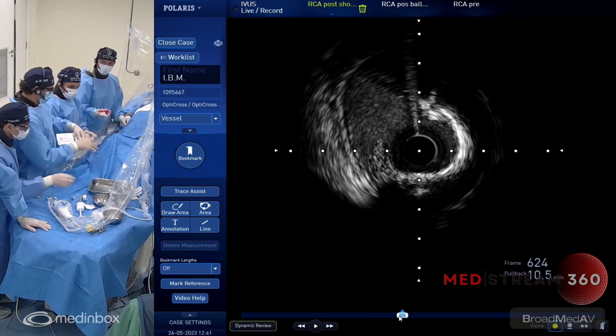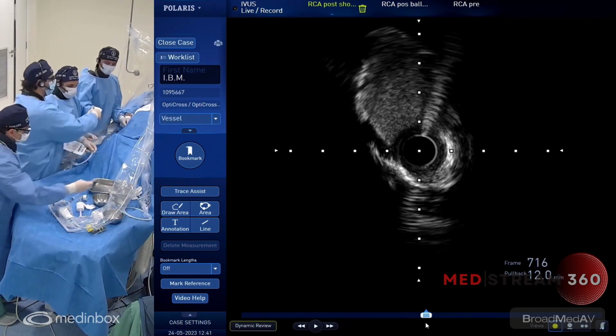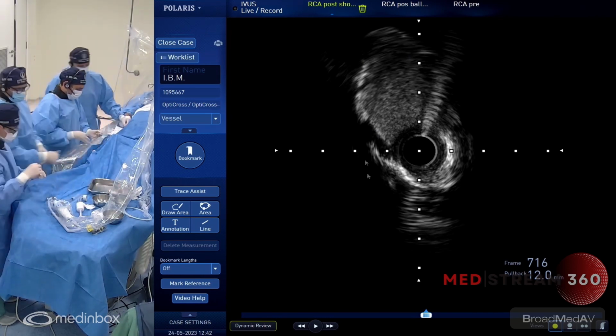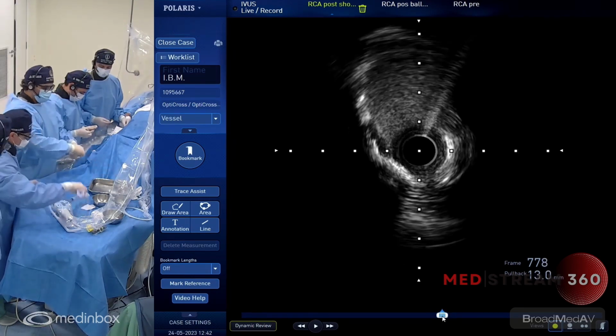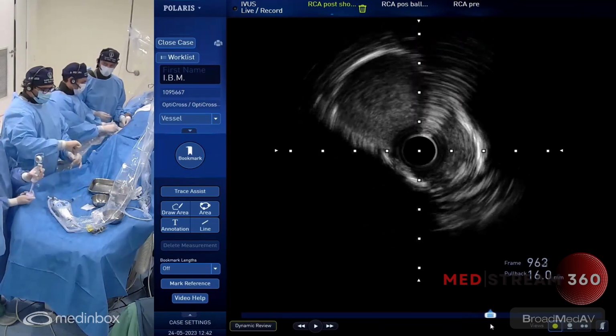Okay. And how about the calcium? Did you see any modification in the calcium? Yeah. And here, that's where we see the discontinuity, the cracking of the calcified plaque, and you do have some gain, but it's still elliptical because of the role that this hard tissue plays here. And so the decision here is going to go with the stent. Another balloon.